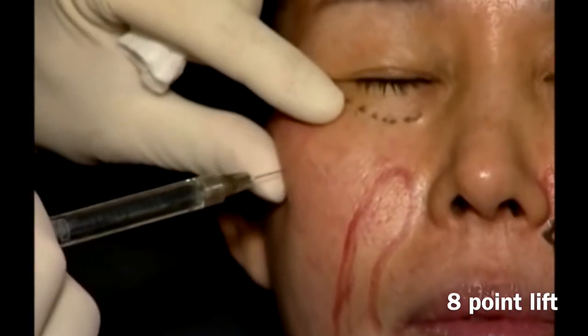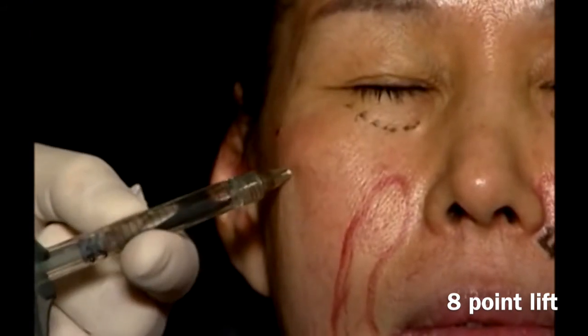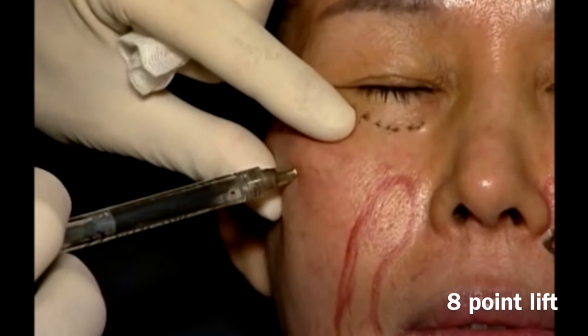Proceed to point number 2. Aspirate. A total volume of 0.2 to 0.3 is injected.